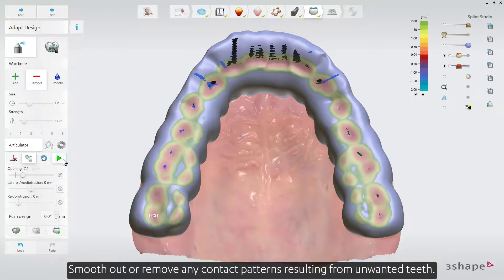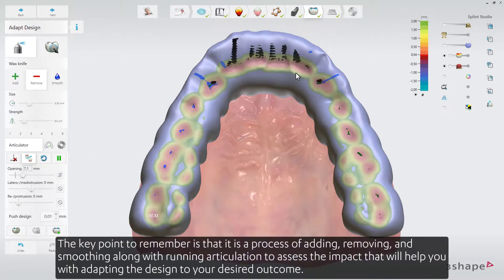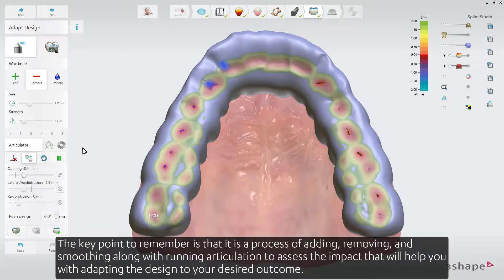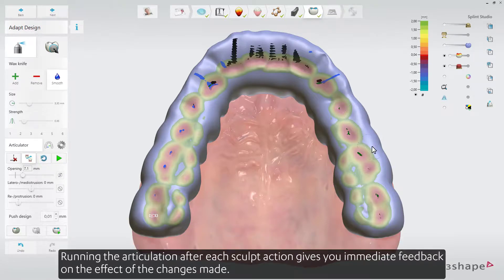Smooth out or remove any contact patterns resulting from unwanted teeth. The key point to remember is that it is a process of adding, removing, and smoothing, along with running articulation, to assess the impact — this will help you with adapting the design to your desired outcome. Running the articulation after each sculpt action gives you immediate feedback on the effect of the changes made.